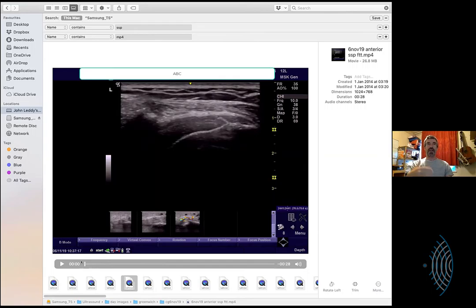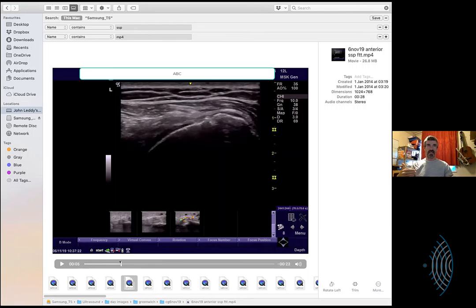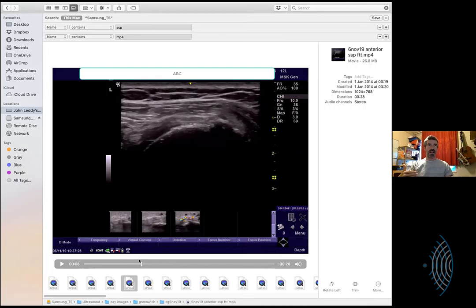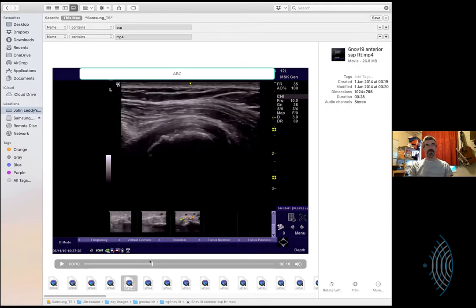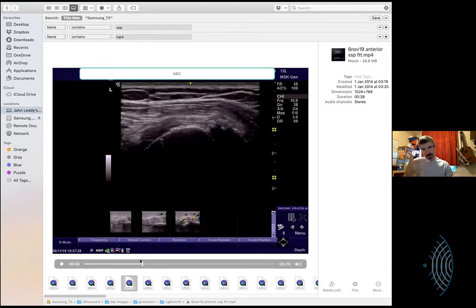I've never really talked about them in terms of facets, but that's just the name. I'm going back to the anatomy books, John, but I understand what you're saying. In terms of how I think about it, I'm scanning the supraspinatus. I'm referring to the bone, but as far as I'm concerned, I'm looking at the tendon. I'm looking at it always in a true long axis, if I can, and I'm at the back of that tendon, and as we're scanning through there, I'm coming forwards through the tendon, or what should be a tendon. And I know that I'm going forwards because at some point you see what little greater tuberosity there is fall away, and I see a biceps tendon.